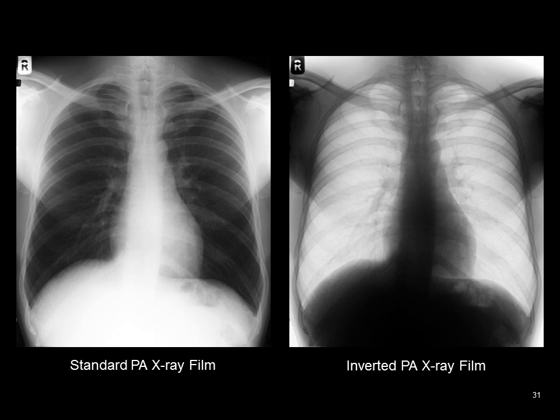If I didn't have this here indicating that it was a PA film, I would know that because the scapulae or the shoulder blades are rotated out of the way of the apices of the lung fields. The vertebral border of the scapula is almost even with the border of the ribs that we're seeing here. I'm pointing this out to you using the laser pointer.